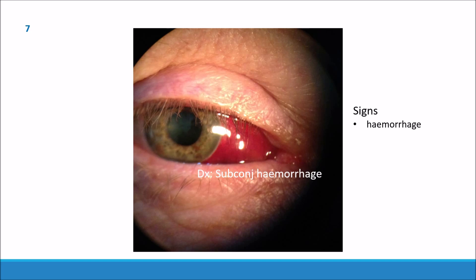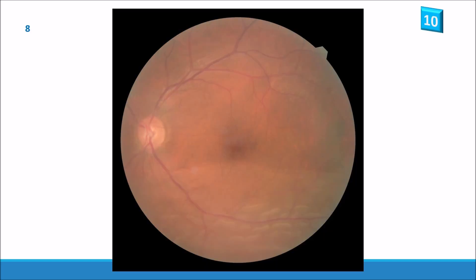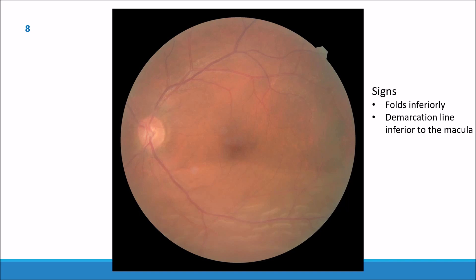And here's slide eight. Here we have folds and wrinkles inferiorly and they clear the demarcation line just below the macula. This patient has an inferior retinal detachment.